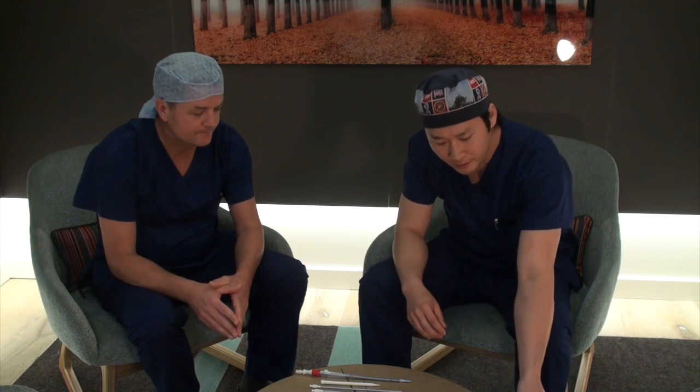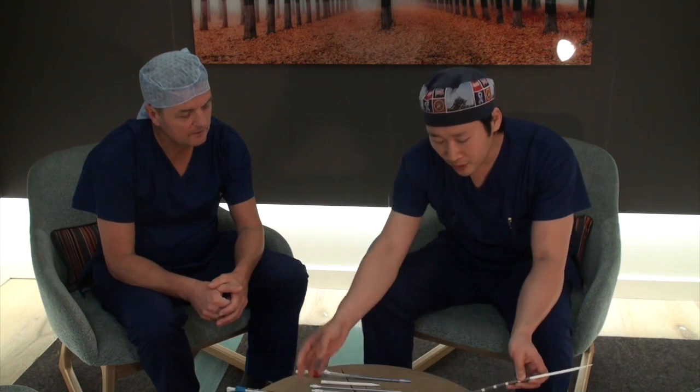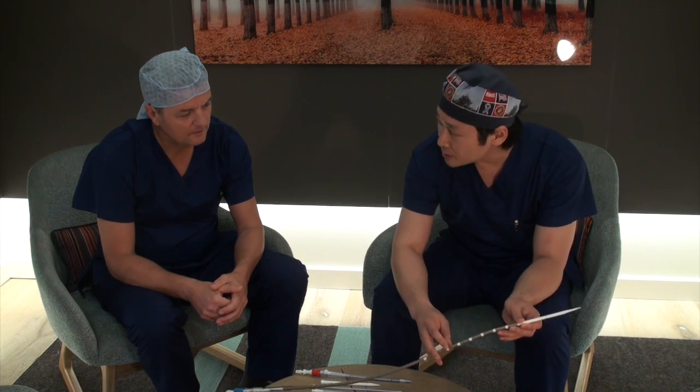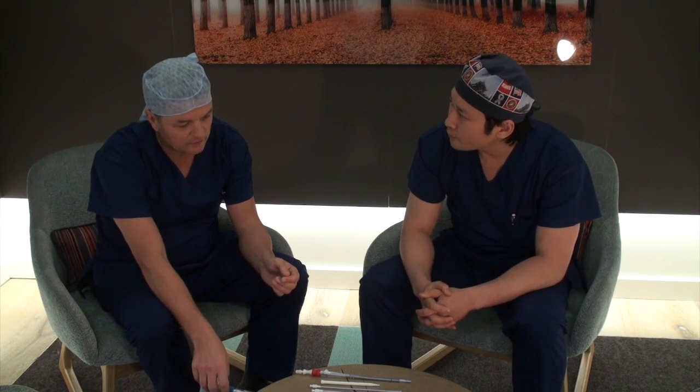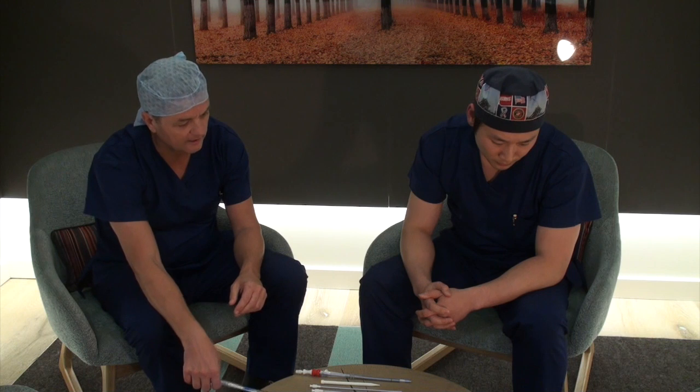When you've passed the guide wire and are trying to feed this multi-stage, multi-perforated femoral venous cannula over it and you encounter resistance, for example at the level of the pelvic rim — first of all, I use dilators for all my venous cannulations. I not only use the cannula over the guide wire; I use all dilators. We also bend the table a little bit. If you feel any resistance, don't progress. Make sure that you don't advance the cannula against any resistance at all.